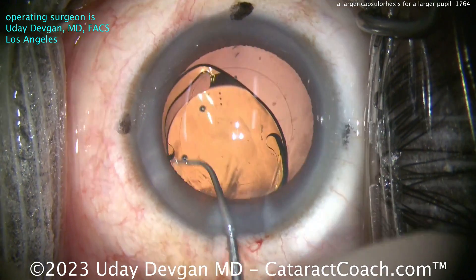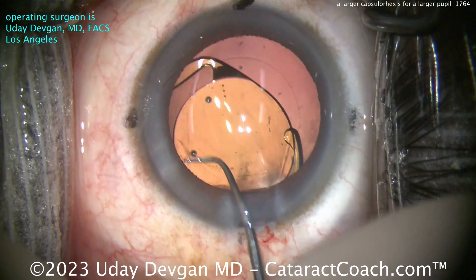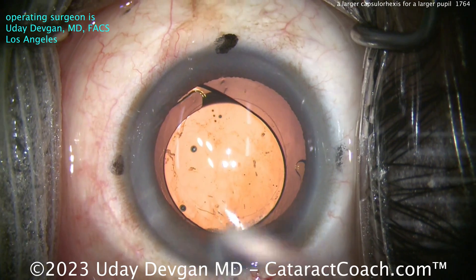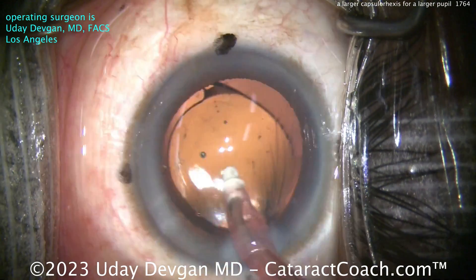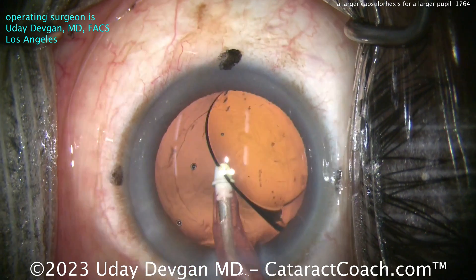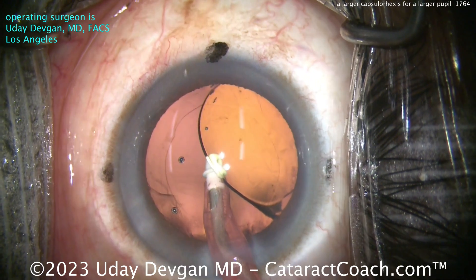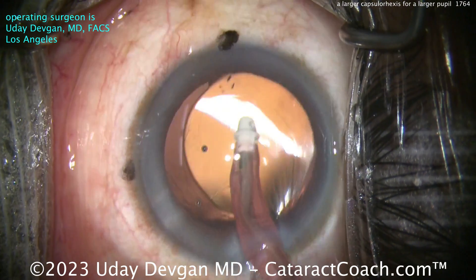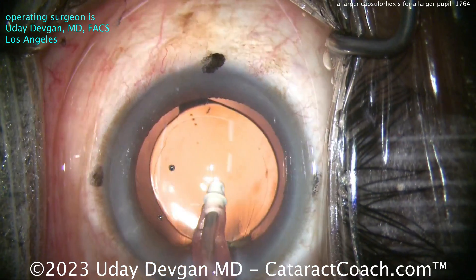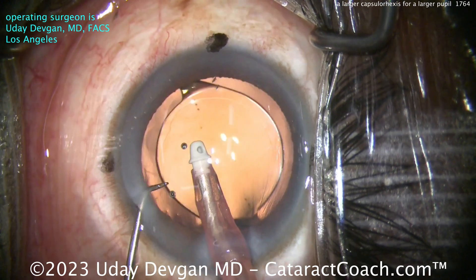We also have to get this lens lined up at the appropriate toric axis. A little more polishing of the anterior capsular rim — get all that little debris off and aspirate all the lens material as well as all the viscoelastic from behind the IOL. Just an interesting case here — it's always pretty routine. If you're a resident or fellow watching this, it's May or March of your last year of training — a couple more months and you're done. You need to make sure you're getting those skills up.